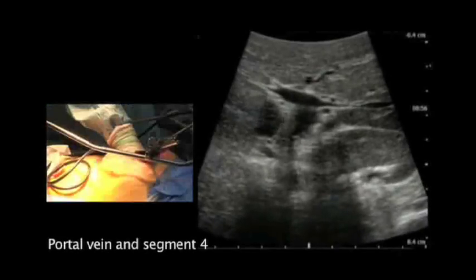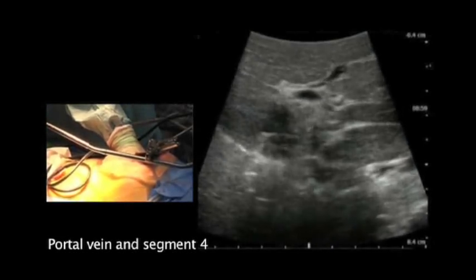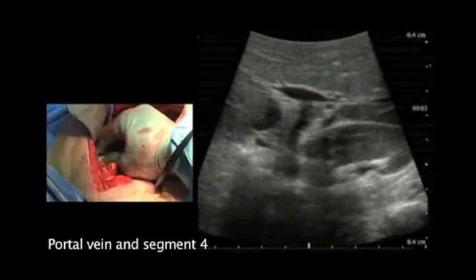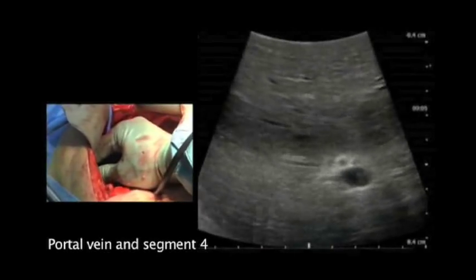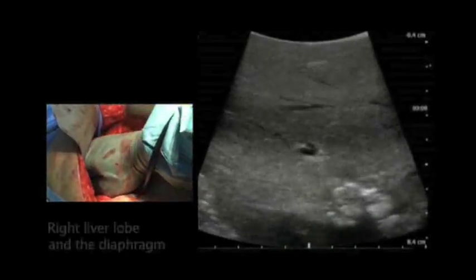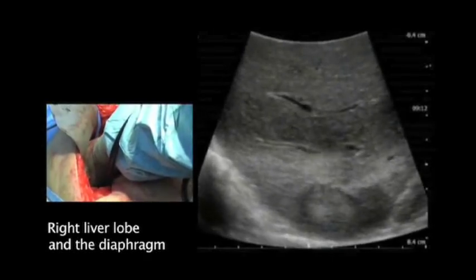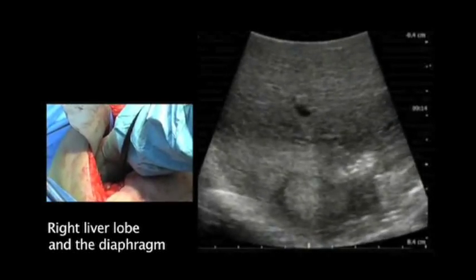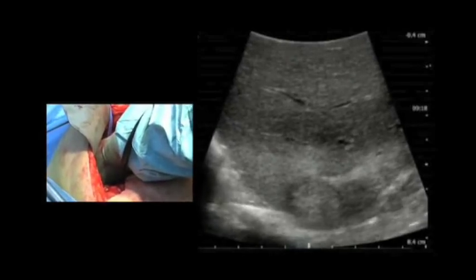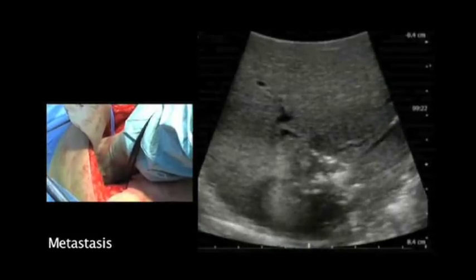Centrally here we have the portal vein — the branching between the left and the right portal vein. In front of that we have segment number four. Beside it, to the right in the patient, we have the large right liver lobe, and on the back side of the liver we can see the diaphragm as a white line. In front of that we can see the metastasis, which is the subject for this surgery.